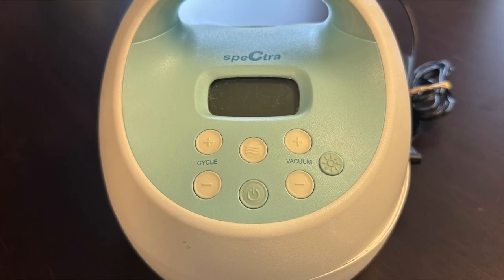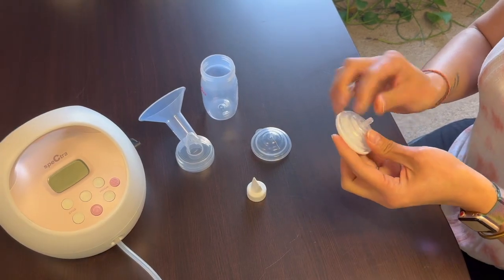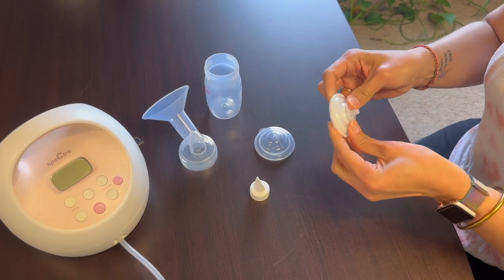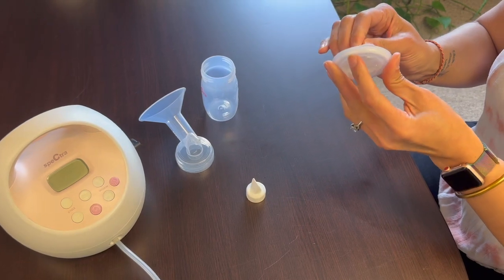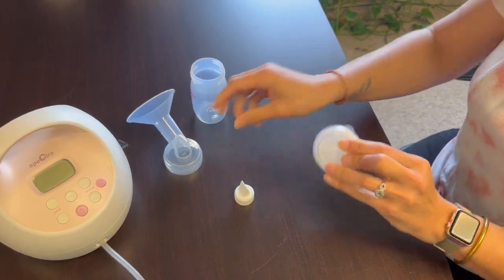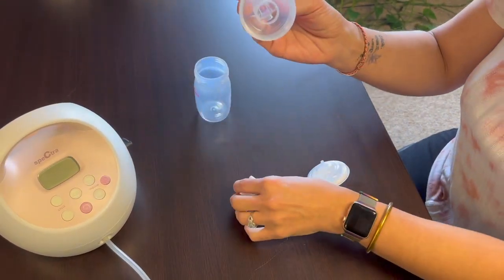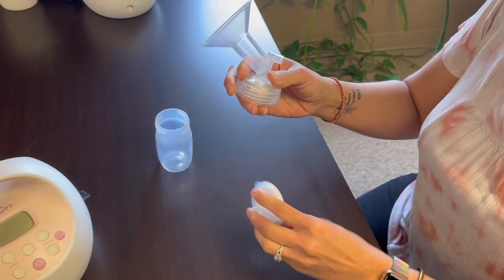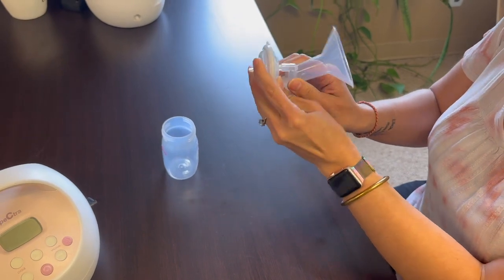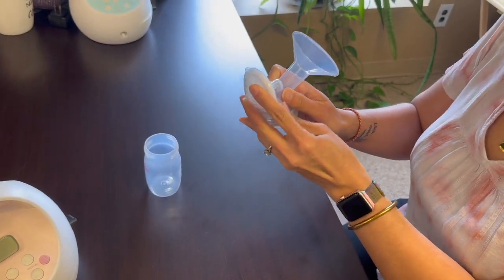So now we're going to put together the pump parts. You will have seven parts on each side, and there are two different size flanges in the package from Spectra. One is a 24 and one is a 28. First we have our backflow protector — there are three parts. We have the white duck bill, your tubing, your wide neck bottles, and your flange.